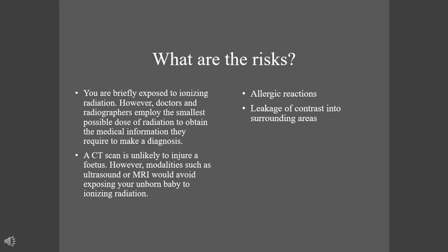Some of the following risks are associated with CT. You are briefly exposed to ionizing radiation. However, every step necessary is taken to keep the dose you receive as low as reasonably possible. A CT scan is unlikely to injure a fetus, but modalities such as ultrasound or MRI would avoid exposing your unborn baby to ionizing radiation.